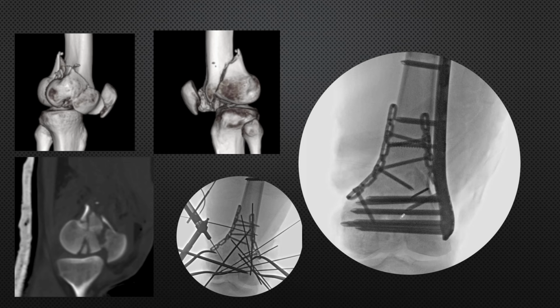Now when you are putting these screws, you have to see the medial side as well. That means when you are putting these screws, you should ensure that no screw is displacing the fragments that you have reduced here, and if that is happening, you have to remove that screw or shorten it so that it is not hampering the reduction on this side. Now we are done with the reduction of most of the side, but we still have to stabilize the medial side.